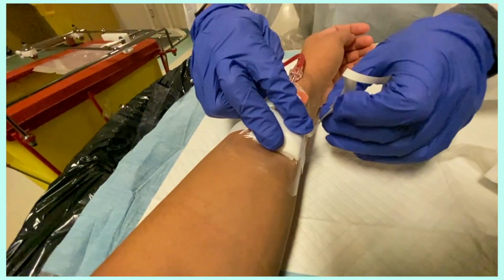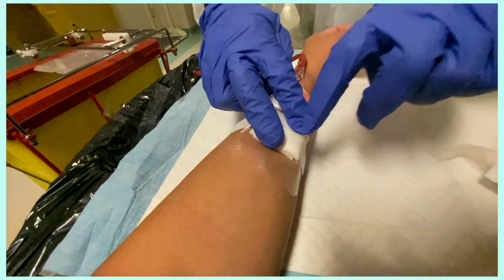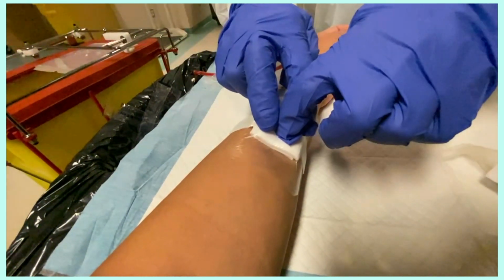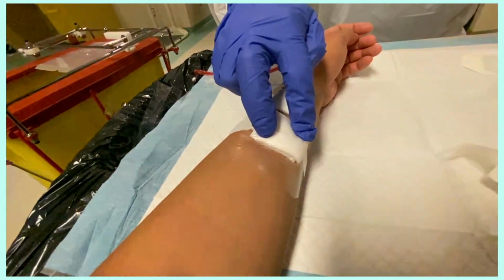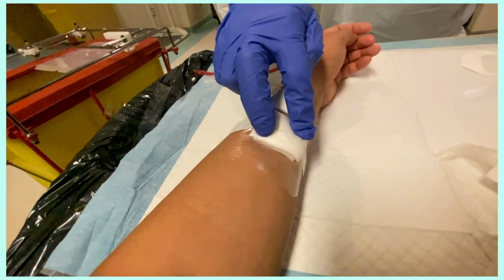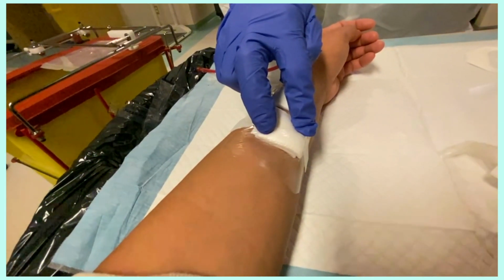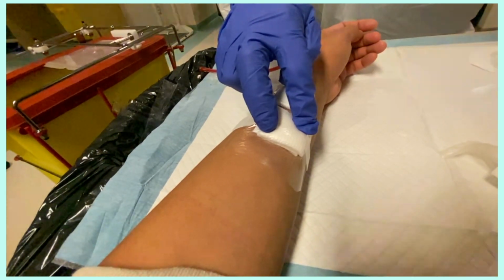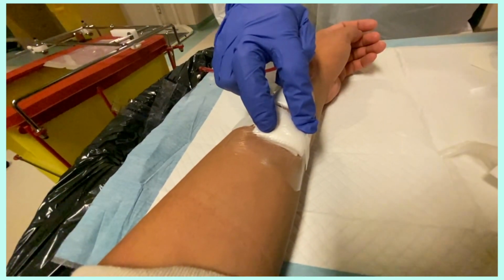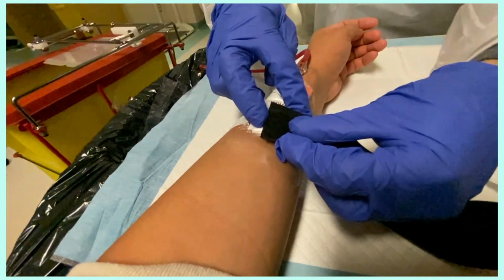And then this particular day, I ended up using a strap for my fistula to be held, but I got scared and then stopped filming because I wanted to hold it myself, because straps are not recommended to be used for new fistulas. They don't recommend it because they don't want anything to not make it work. Like, you want your fistula to work, so they don't recommend it. And sometimes I do get lazy, so I use it, honestly, but yeah.